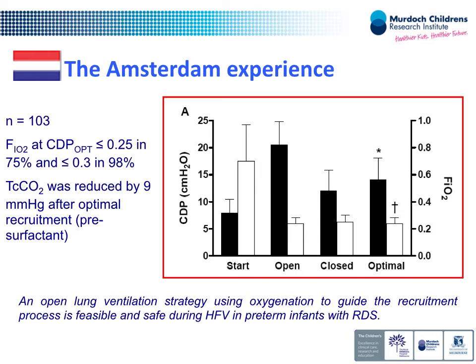We're worried about the babies that get into trouble in the second week of life with inflammation, pneumonia, apnea, necrotizing enterocolitis. And then you start ventilating these babies. I would love to do a trial randomizing these babies to a lung protective oscillation strategy versus a conventional, much more difficult way to ventilate these heterogeneously diseased lungs. For those babies, this isn't necessarily the right way to be lung protective.